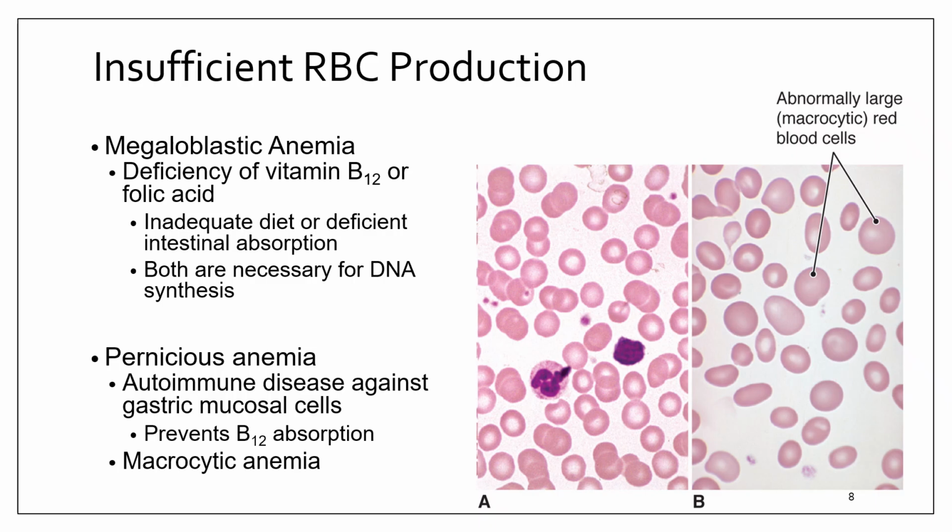These deficiencies can occur due to inadequate dietary intake, malabsorption in the intestine, or increased metabolic demand. But histologically, B12 and folate deficiency look nearly identical. The microscope doesn't care why, it just shows you the result.